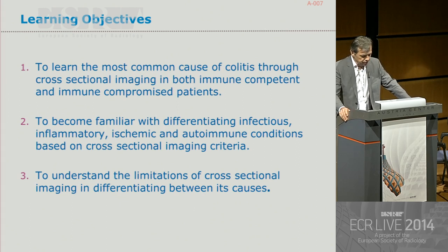The learning objective of this lecture is to learn the most common causes of colitis through cross-sectional imaging in both immune-competent and immune-compromised patients, and to become familiar with differentiating infectious, inflammatory, ischemic, and autoimmune conditions based on cross-sectional imaging criteria.